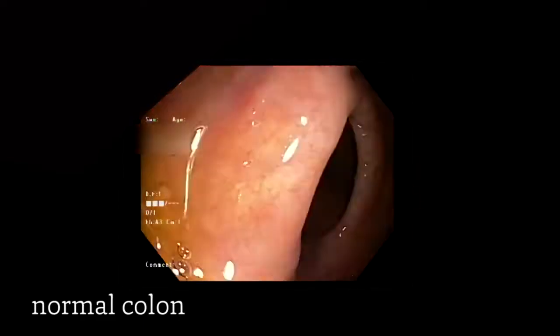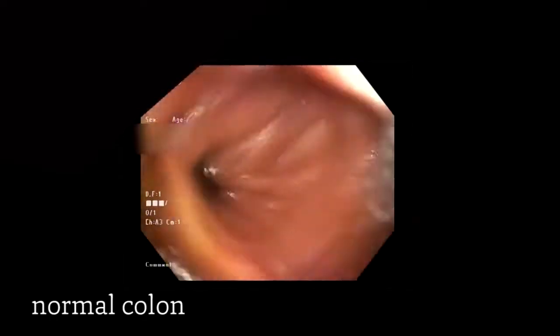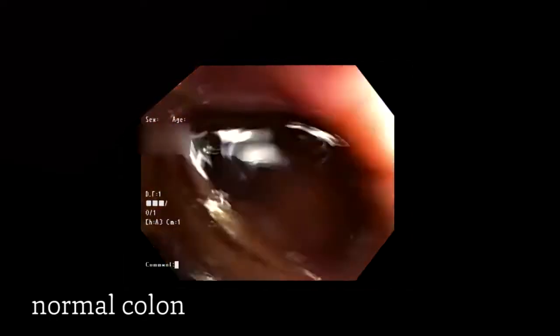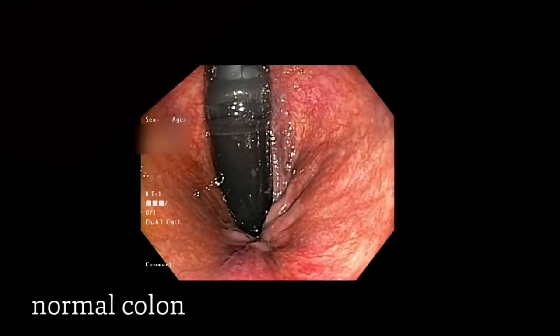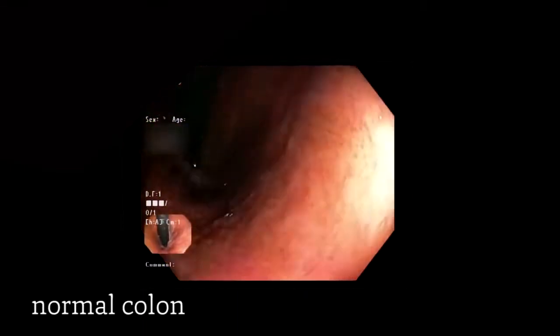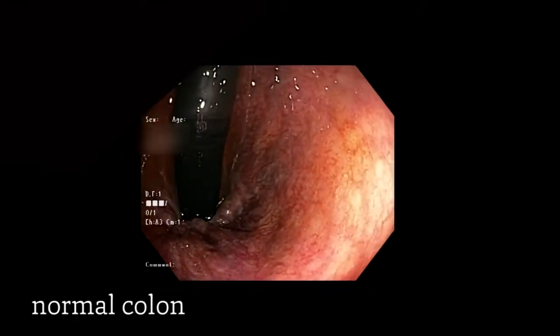At this point, the last part of the examination, we do what's called a retroflexion, in which we turn the camera back on itself to look at the anal verge and look for anything like polyps that could have been missed on the way in, or hemorrhoids. In this case, our patient has some small hemorrhoids, as you can see there. But the good news for this patient today is that no polyps were found.